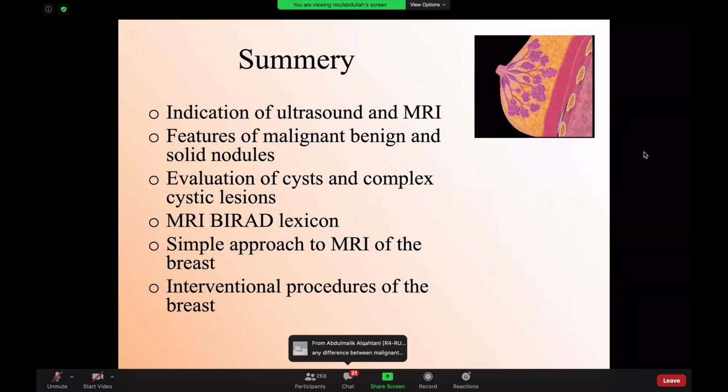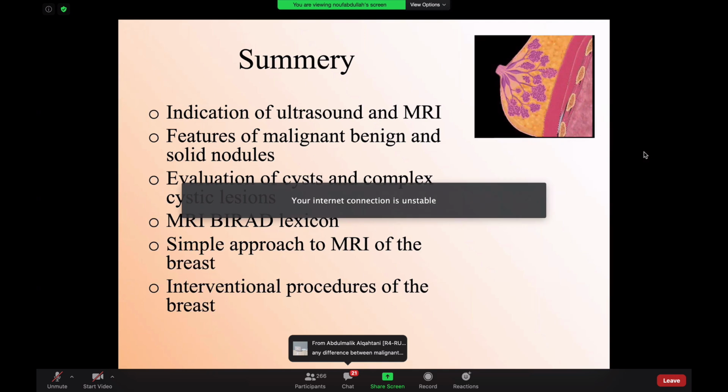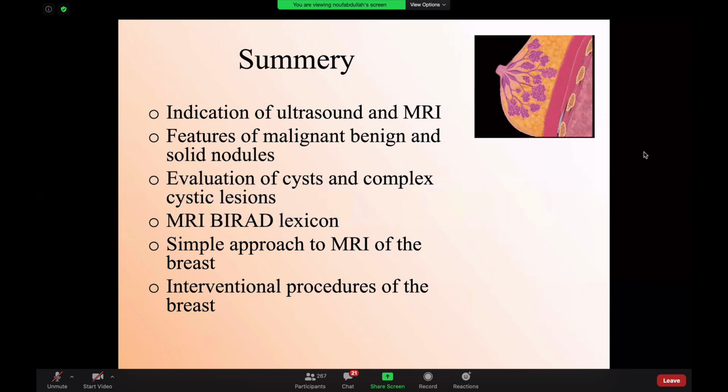About the elastography. Does it add much to ultrasound diagnostic capability? So elastography is helpful in differentiating, generally speaking, and this is where elastography came out, in differentiating between BI-RADS 3 and 4A. So it is helpful, but I would say that the specificity is very low. So I wouldn't use it except like at a resident level. I would be very careful in using it differentiating 3 and 4A.